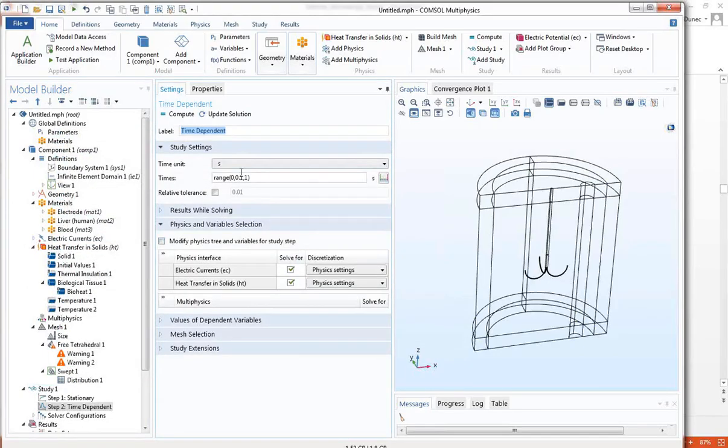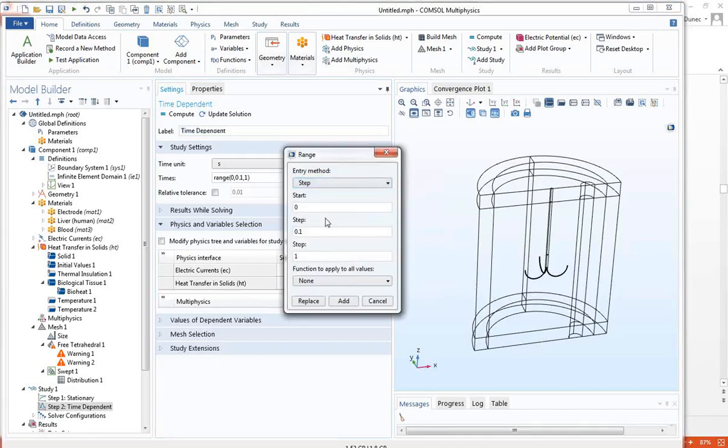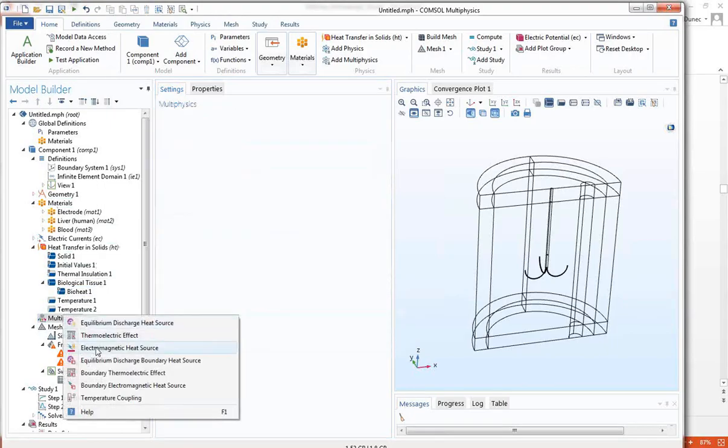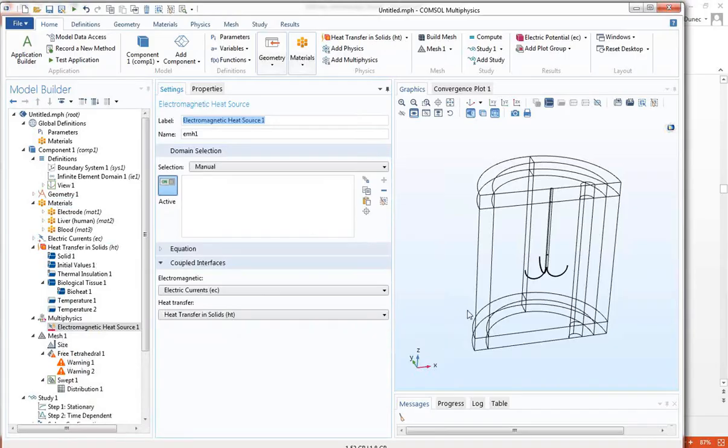Okay, I'm missing one thing. I've got to link the physics in this thing. So let me do that separately. And I want to step by 10-second intervals, and I want to go for 600 seconds. Okay. And replace that. Okay. The thing that I forgot also is I've got two independent physics right here. What I want to do is I want to link them. So I'm going to do an electromagnetic heating. That is in the tissue right here.